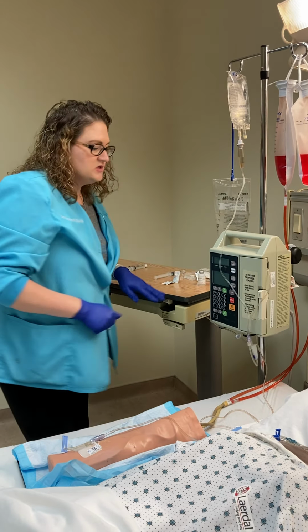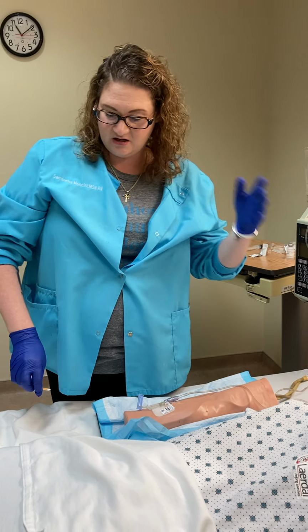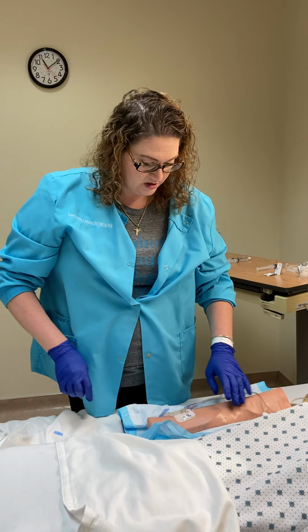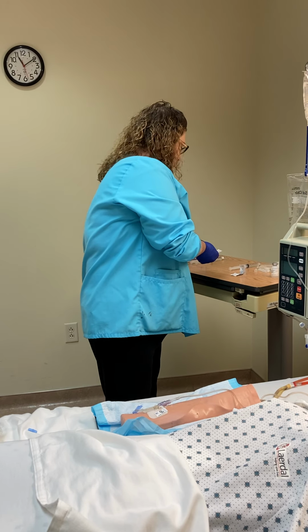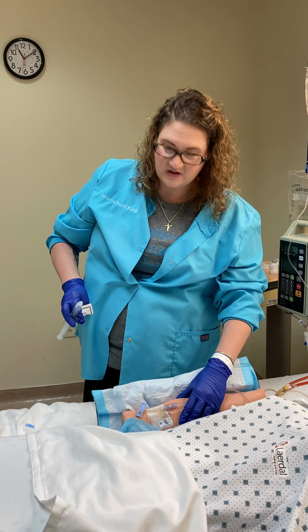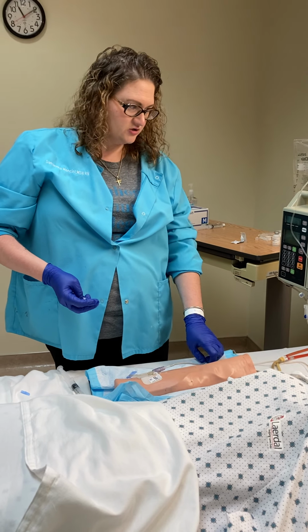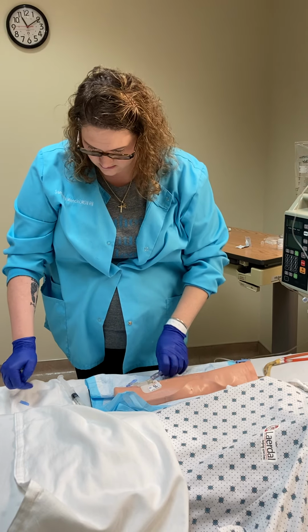All right. So what do we do? Say we're going to discontinue our fluids, convert it to a saline lock, and then I'll show you the IV push through just a J loop. As far as converting to a saline lock, that's just leaving the J loop in with nothing else. You don't really need to do anything special. Usually all of this is going to come down and we dispose of it per policy.